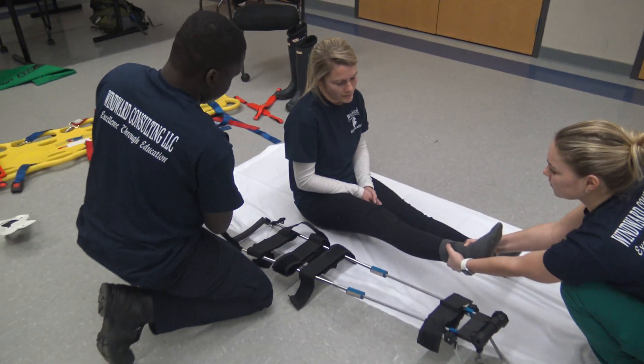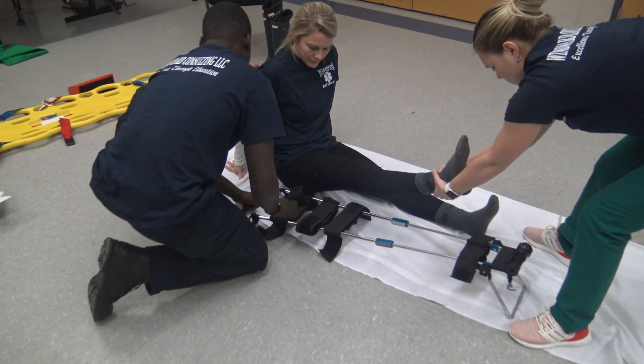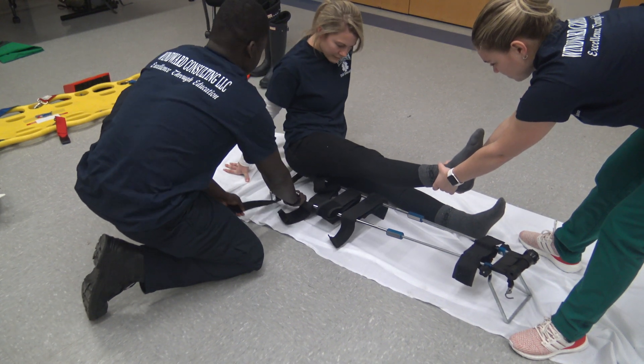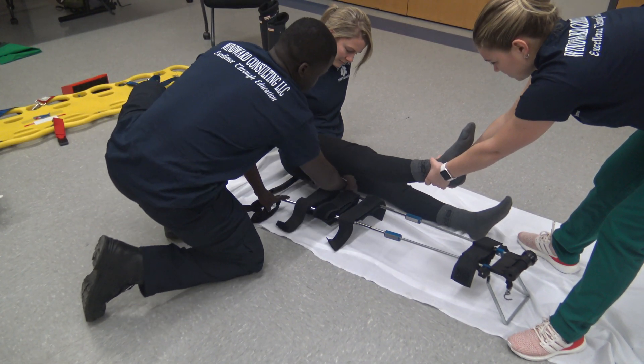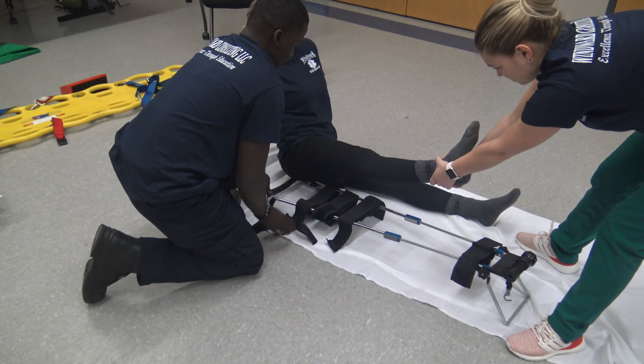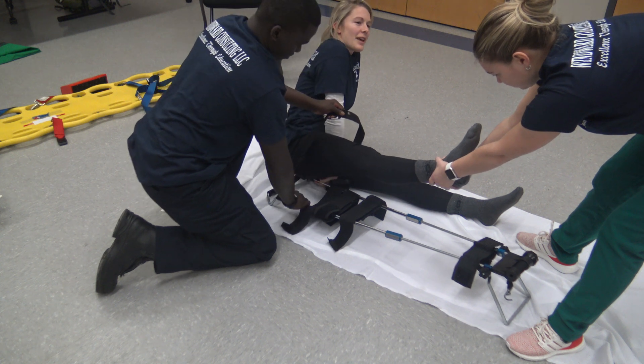Now I'm going to get ready to apply the traction splint and palpate for the ischial tuberosity. At this point in time I'm going to secure the first strap, the ischium strap.